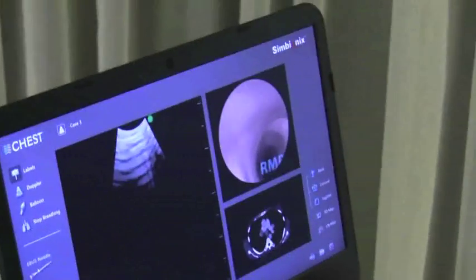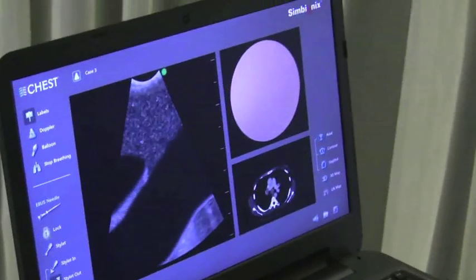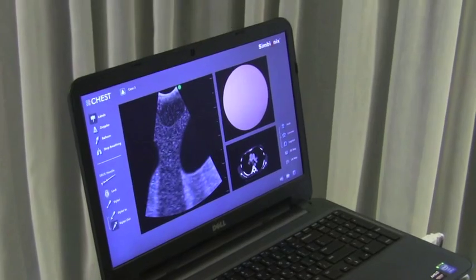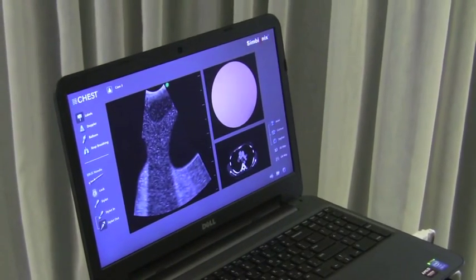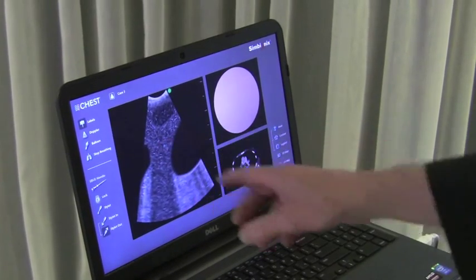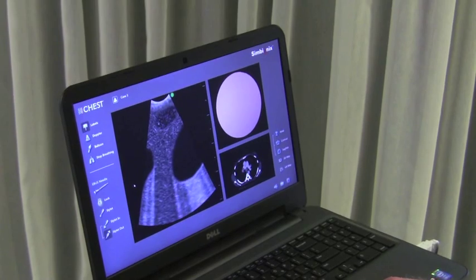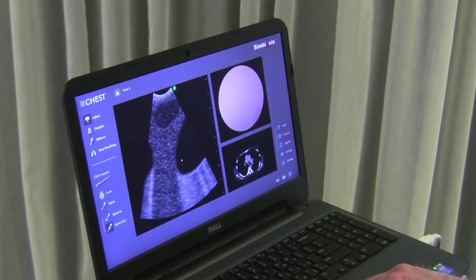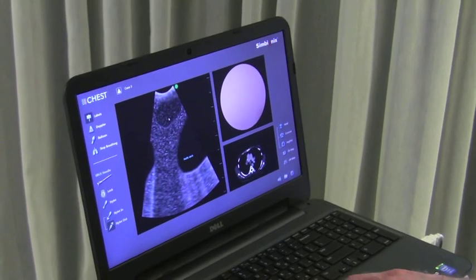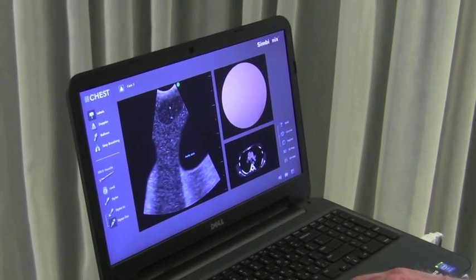An example of the utility in this system is lymph node sampling using technology called endobronchial ultrasound. In this situation, we have a lymph node with a blood vessel on either side, and the simulator allows the student to identify the structures. Here you can see this is the aortic arch. They know that this is a left-sided 4L lymph node.